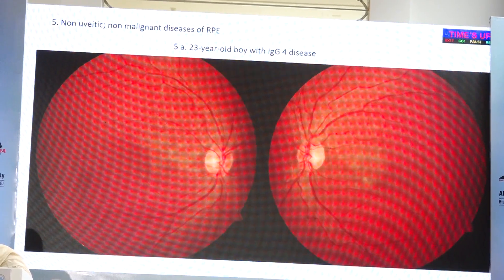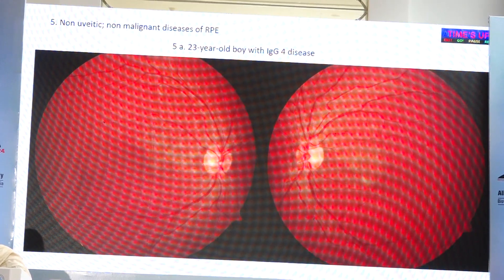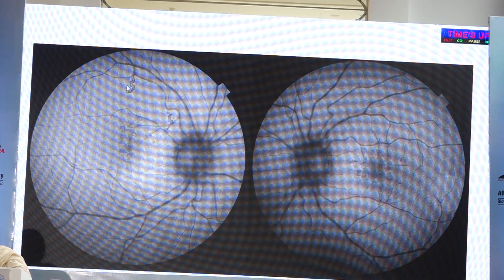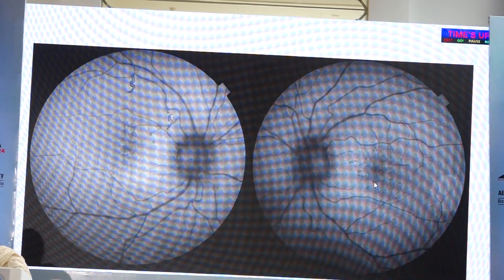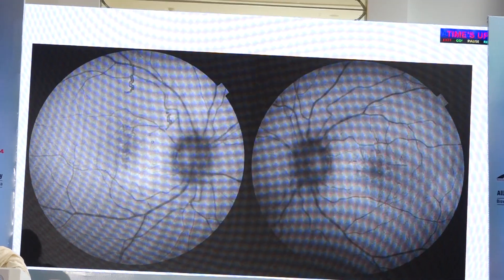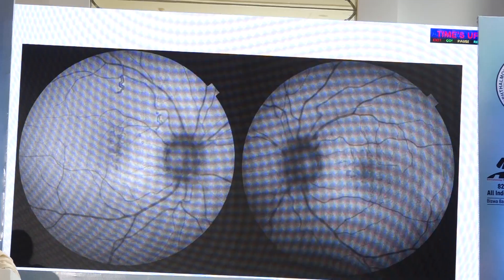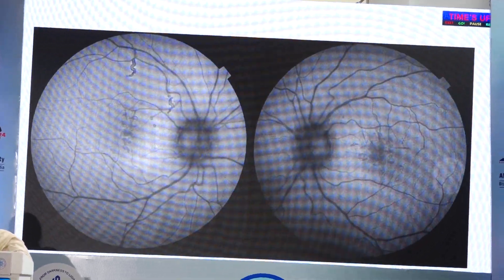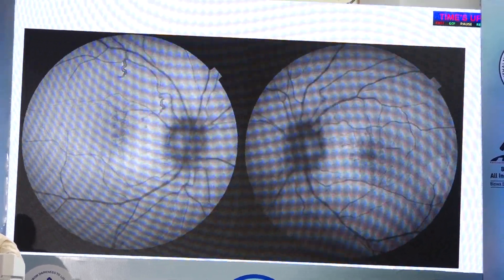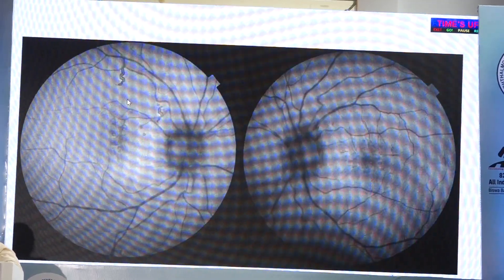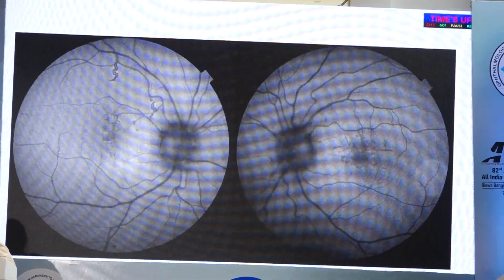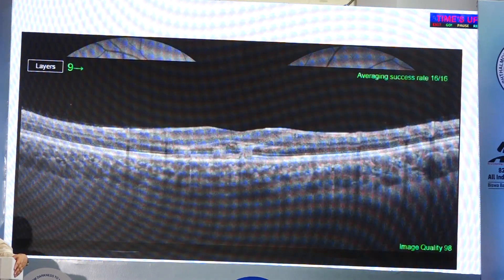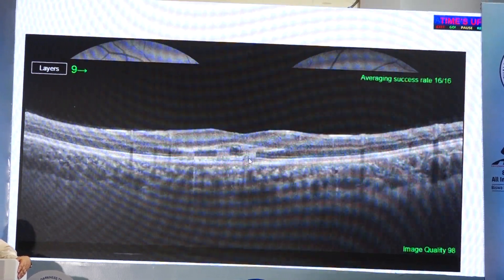The last part covers non-uveitic diseases — not uveitis, not deposits — which can sometimes be confused. This child had IgG4 disease and had findings like this. When we did autofluorescence, we saw discrete lesions. This is not a feature of subretinal deposit, retinitis, or choroiditis. History is very important: the child was playing with a laser pointer. Laser pointers in toys can produce laser burns which can be confused with uveitis entities. In this patient, it was confused because of an associated systemic disease, and many may receive unnecessary steroids. This is the classical OCT appearance of laser scars.